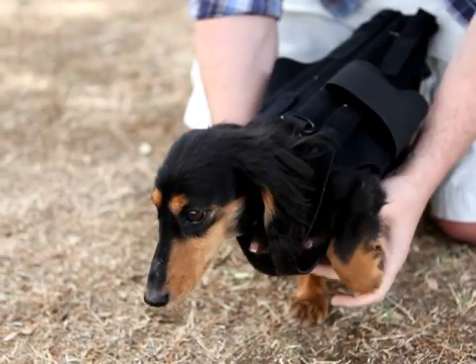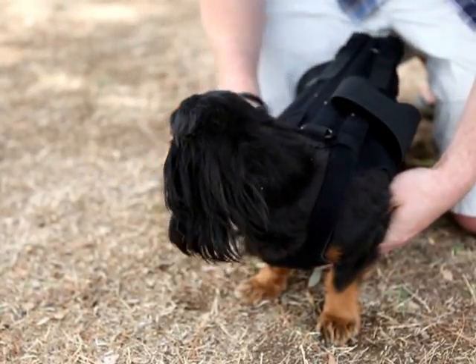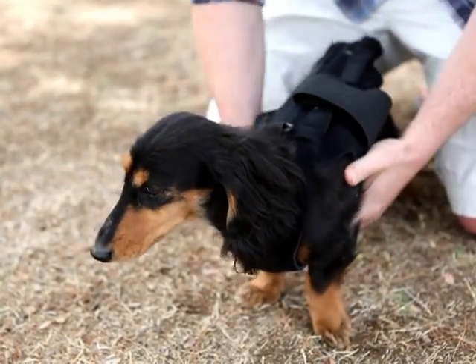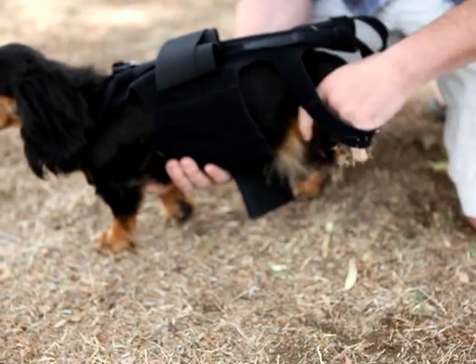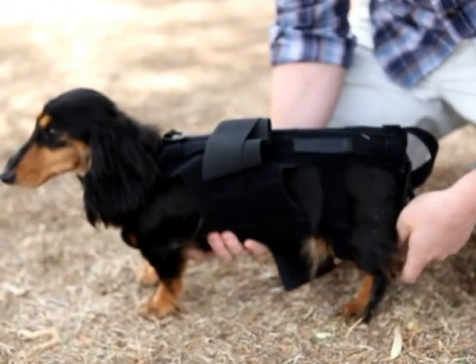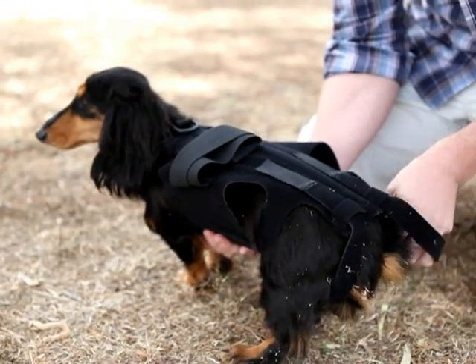Take her left front paw, put it through there, and then we're going to take her rear legs and put them through the rear holes, as well as this back part.